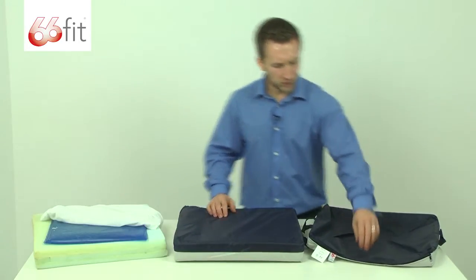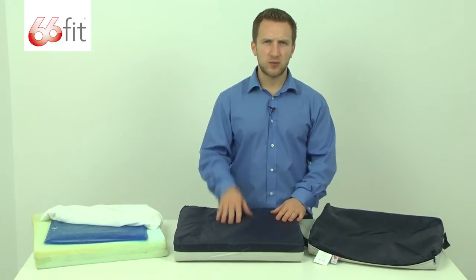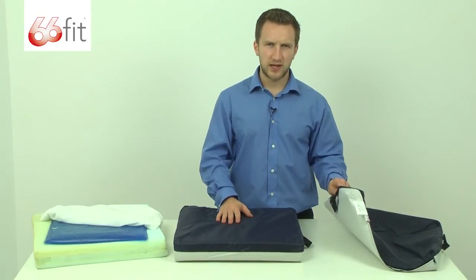This is completely washable. There's a zip here, so if you want to take this off and you need to wash it, you can either hand wash it or you can put it in the washing machine — that's completely fine.